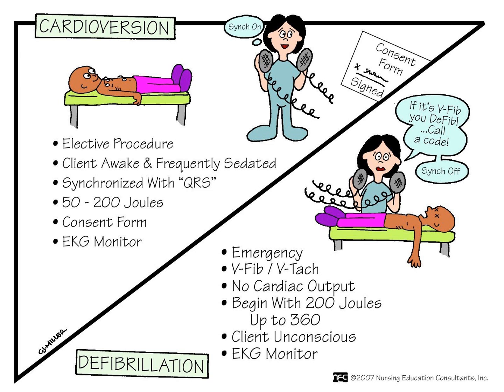This is used to treat VFib and VTach. Remember the problem with those two dysrhythmias. These are lethal dysrhythmias, and it's because the heart has such a decrease in cardiac output that we're not even able to perfuse the vital organs, especially the brain, and therefore the patient becomes unconscious. We begin with a higher joules, like 200, and of course they're going to be connected to an EKG monitor so that we can observe and monitor the EKG response to this shock.